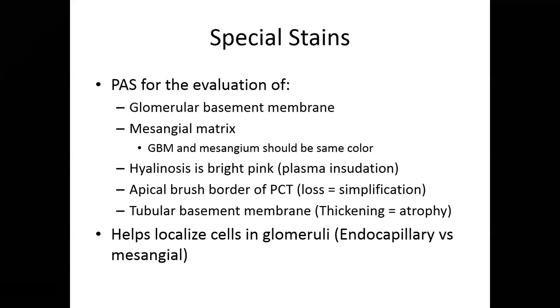If one is much thicker than the other, then there's probably a lesion. And then we, as pathologists, use the PAS to evaluate where the cells are localized. And I'm going to show you pictures of that.